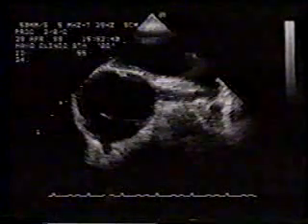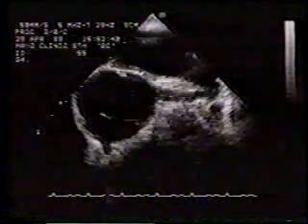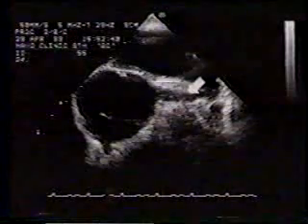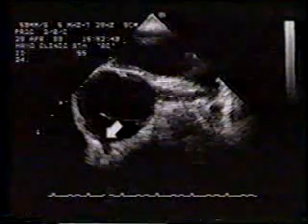Transesophageal echocardiography will further enhance our ability to visualize the left main, left anterior descending, and circumflex coronary arteries. This is a still frame demonstrating visualization of the left main coronary artery using a transesophageal probe. The ostium of the right coronary is also visible.